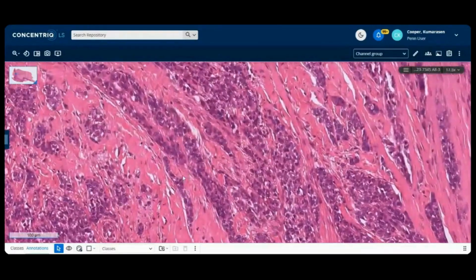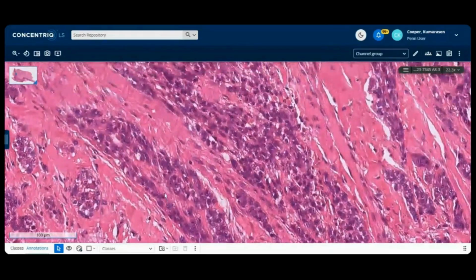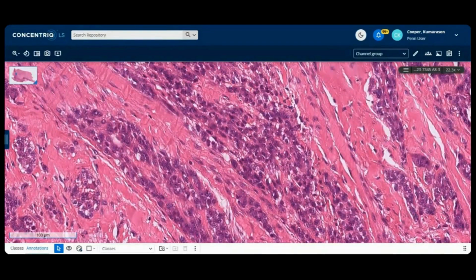So just a nice exercise to think about clear cell sarcoma, and in that context EWSR1, like was mentioned in the comment, is a good FISH analysis to confer with your morphology and your immunohistochemistry.